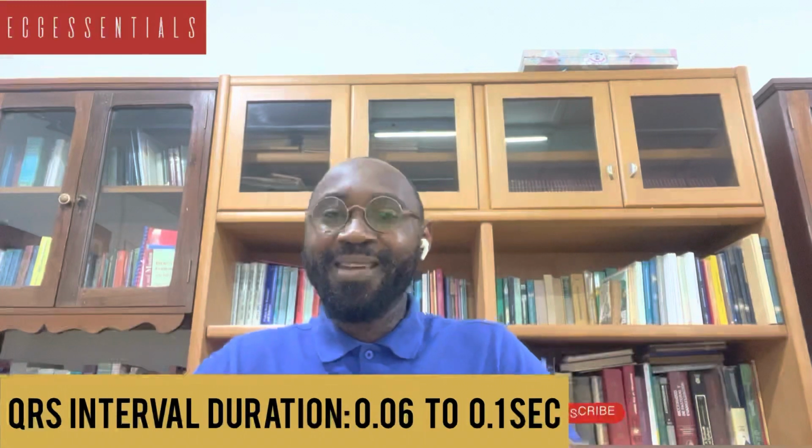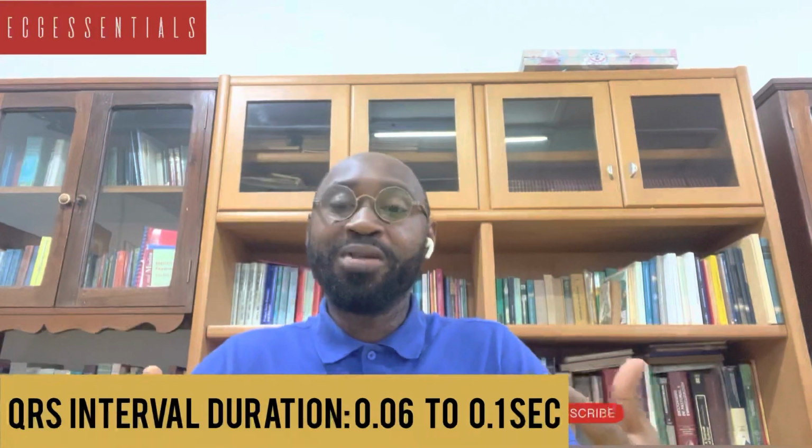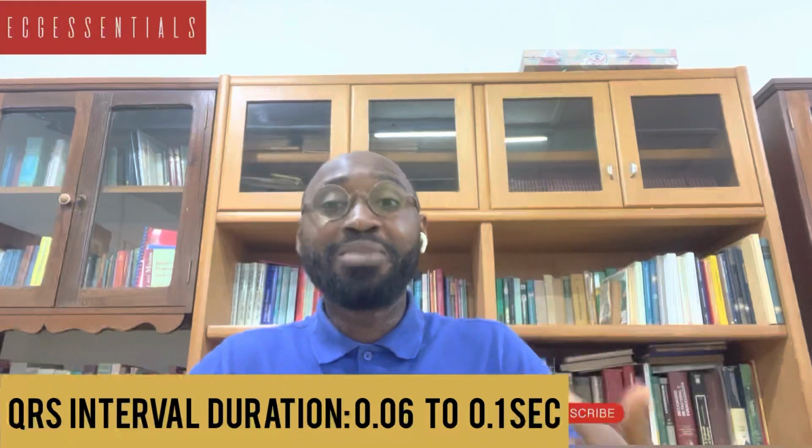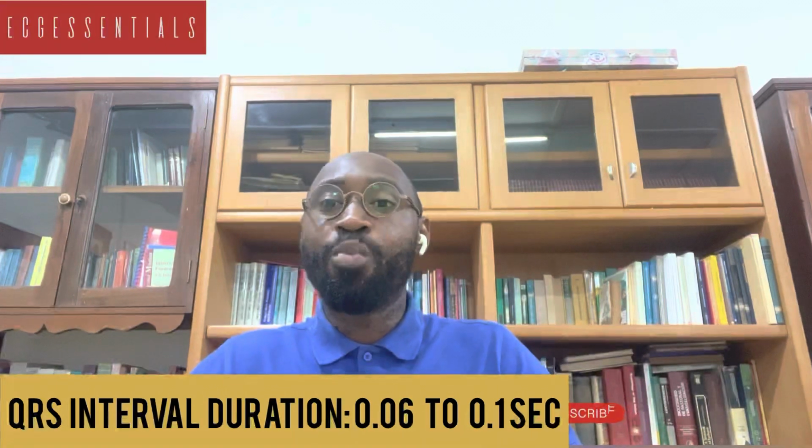Ladies and gentlemen, no matter how the QRS complex looks, it is generally accepted that the duration is between 0.06 to 0.1 seconds. Some texts may extend it to 0.12, but generally that is what is accepted. Some of these intervals we have mentioned, we have to keep in mind so that we'll be able to identify when there are increases in these durations.